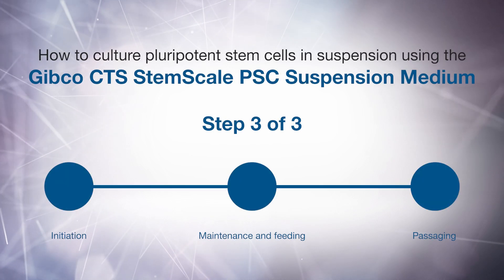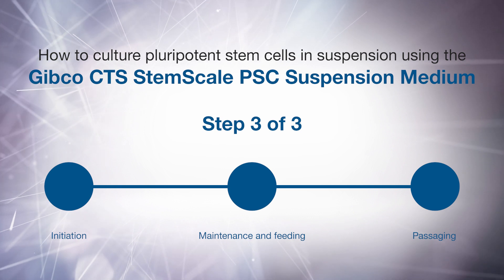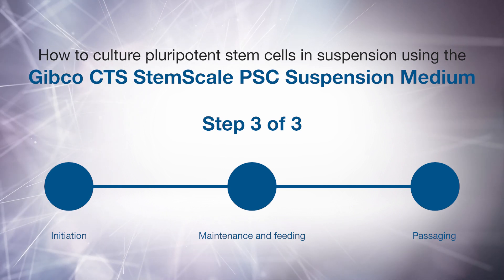How to culture pluripotent stem cells in suspension using the Gibco CTS StemScale PSC suspension medium. Step 3: Passaging.